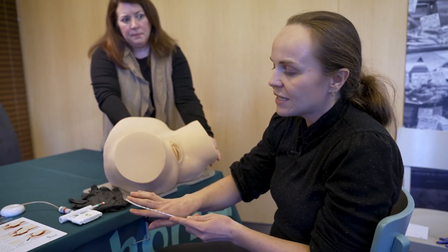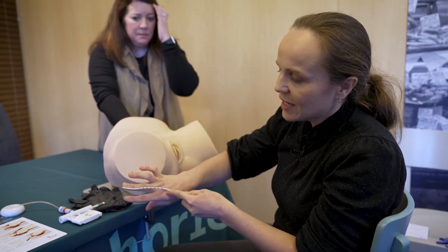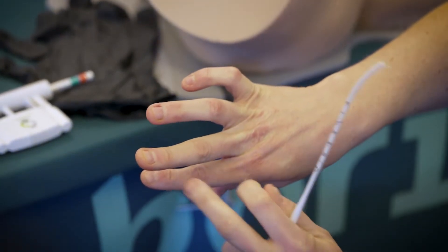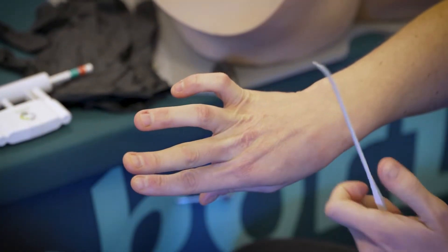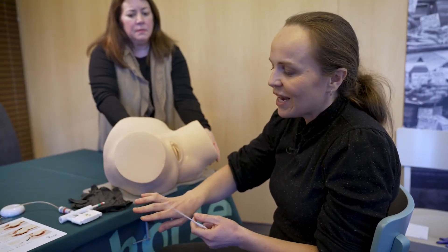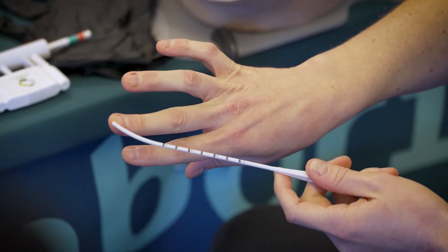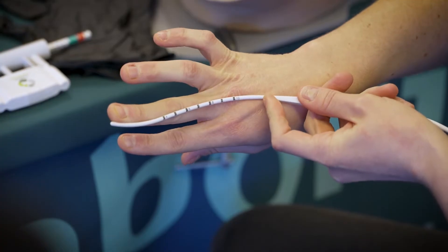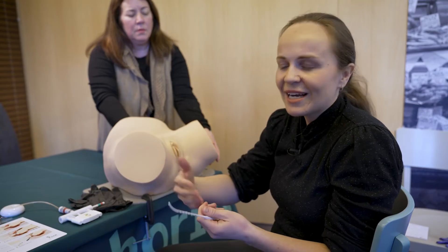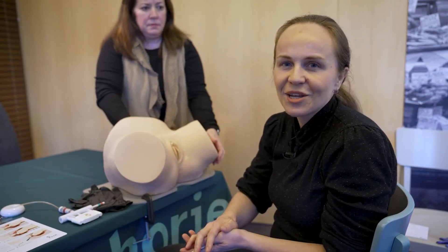The important distances are: from the fingertip to the proximal interphalangeal joint — for me that's five and a half centimeters, and on average it's between five and seven centimeters — and from the fingertip to the metacarpophalangeal joint, which for me is ten centimeters. Using a uterine sound you can check these measurements, so that you can use your finger as a ruler to estimate any distance you need during the procedure.